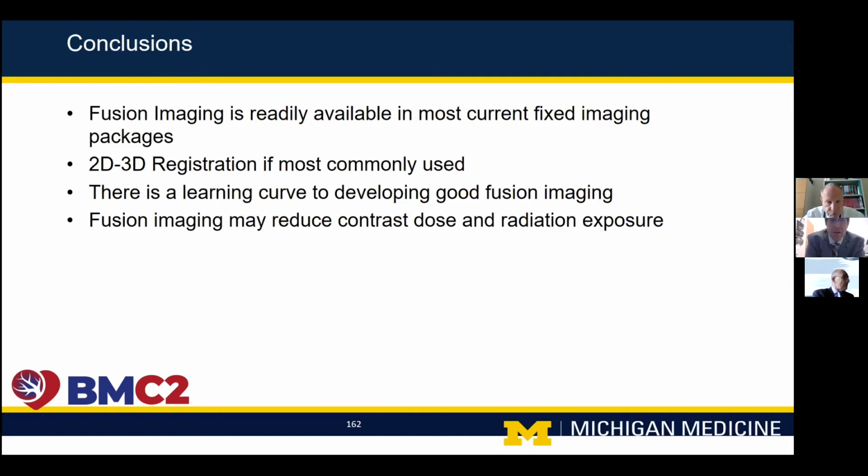The learning curve for this is honestly not that long. It seems daunting the first couple times, when you do your registrations, create your segmented bone and aortic models, and then make your rings. But with a little bit of practice, I think you can get it down pretty fast, to being reliable, where you trust your models to put devices in with fewer contrast runs. If you do this for your first 10 EVARs, just standard EVARs, you'll see pretty quickly how easy and reliable it is.